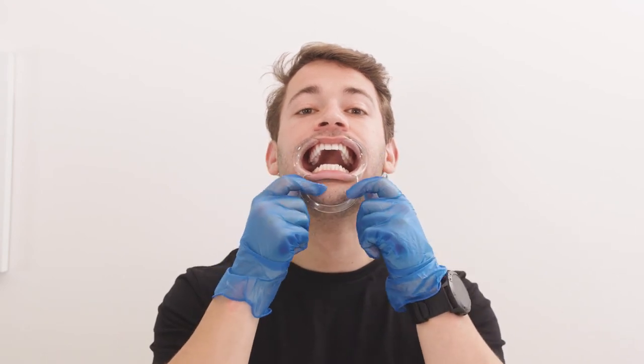The next shot is your upper teeth. We need to see the surfaces of your upper teeth all the way to the back. This photo can also be tricky, so it might take a couple of tries to get right.